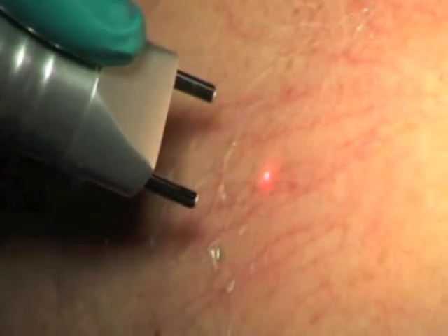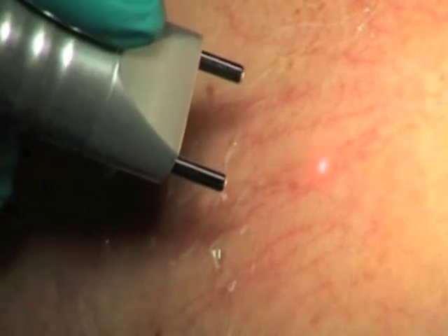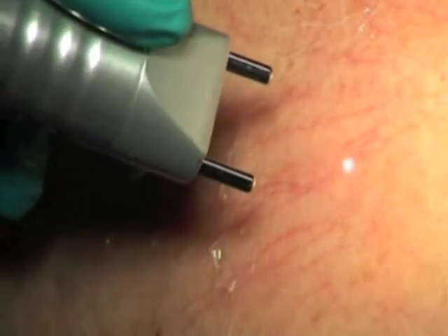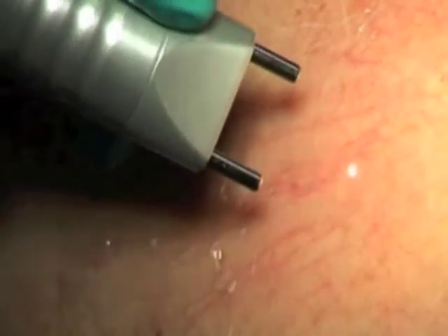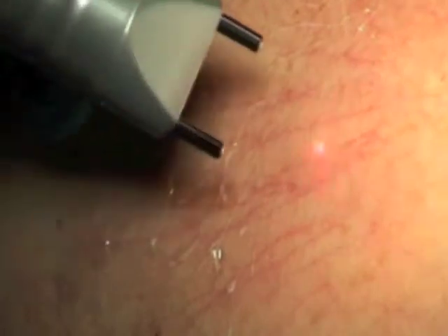We call it cell debris — that's still inside. So you did the coagulation of the vessel, and you can see it very well here point by point. But you will have some cell debris, and this cell debris has to be removed by the body.